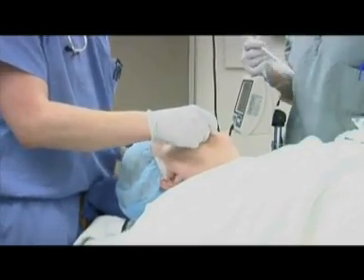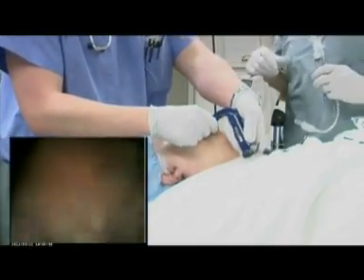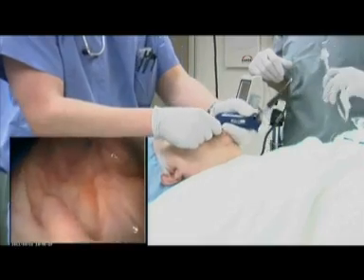Patient positioning is optimized utilizing appropriate support under the upper thoracic and cervical spine, shoulders, and head.